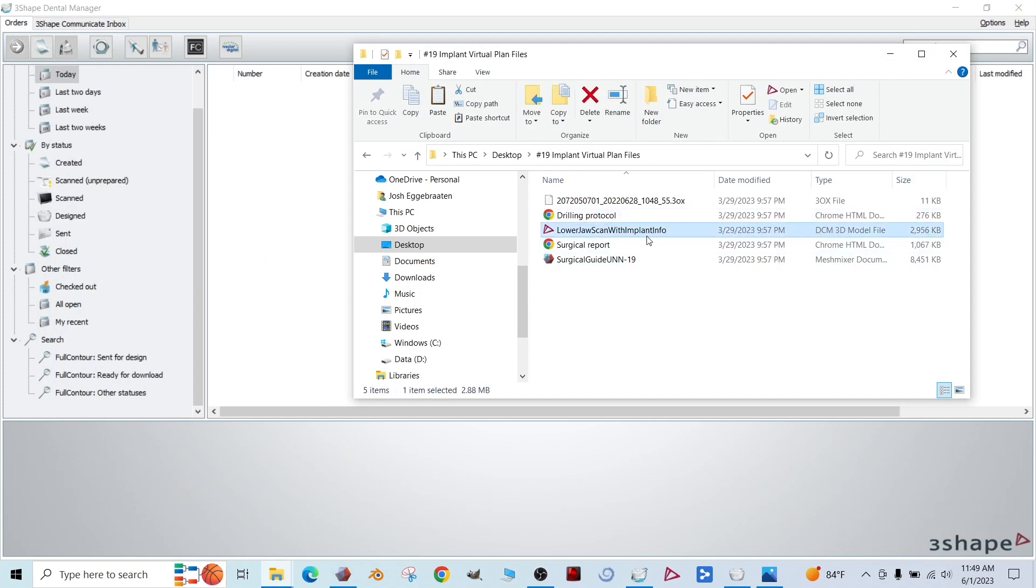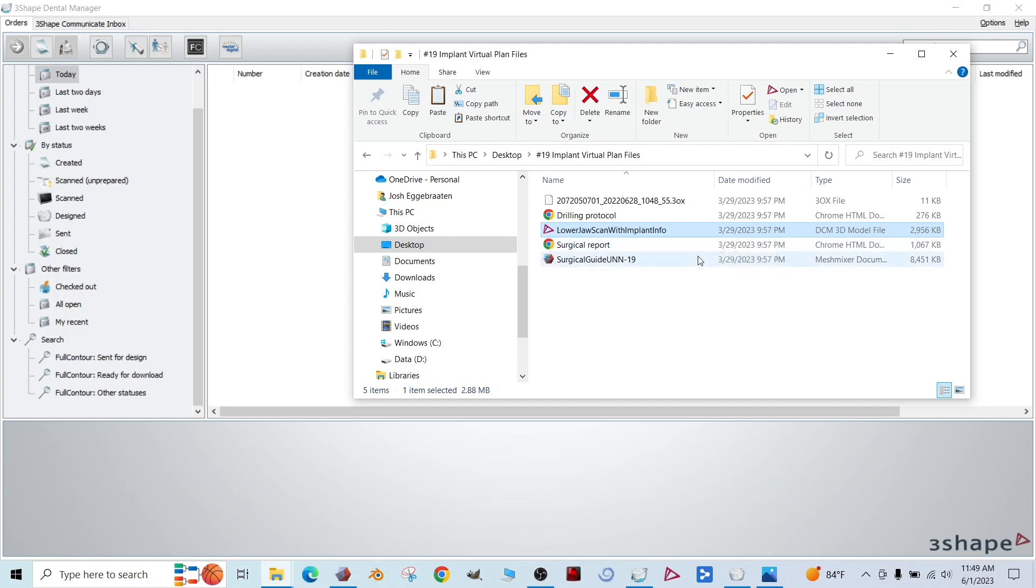There's also this DCM file. Here it's labeled lower jaw scan with implant info. This file holds our intraoral scan, but it's merged with our virtual implant placement. So this is the file we want to use.